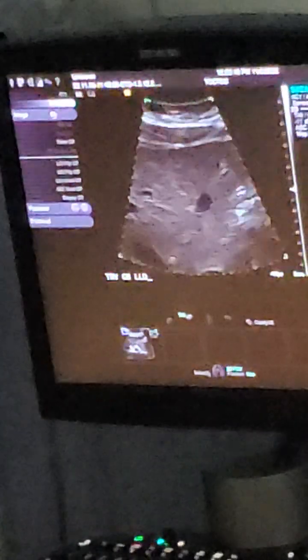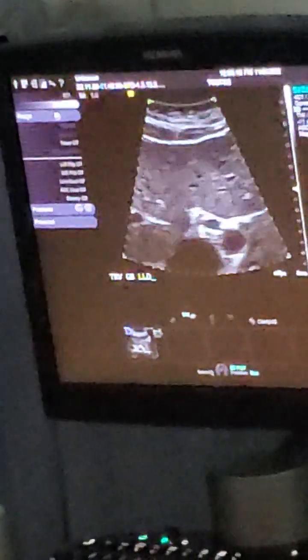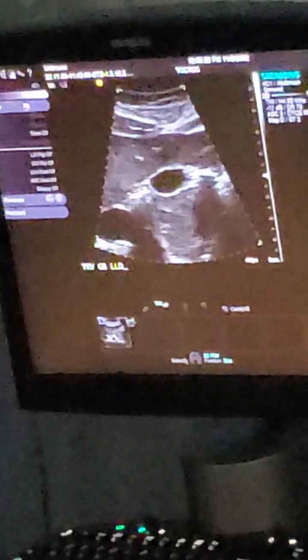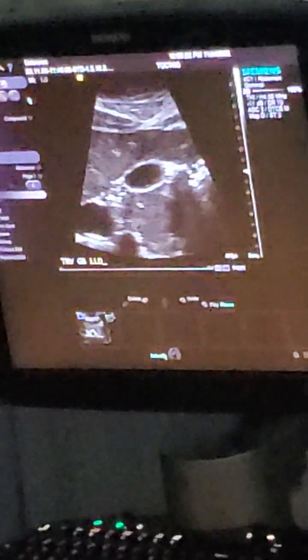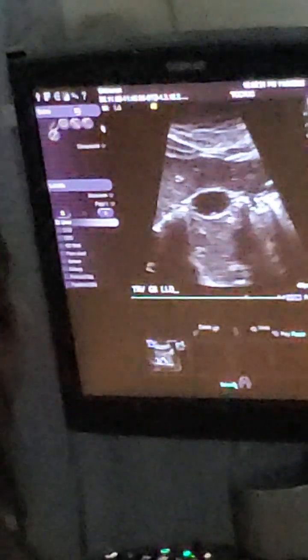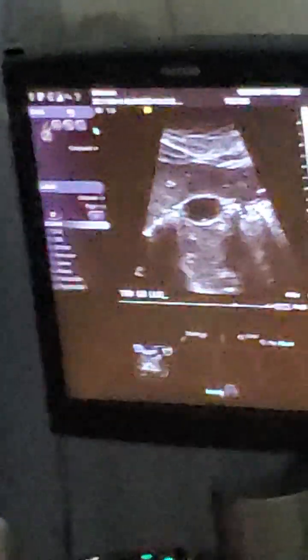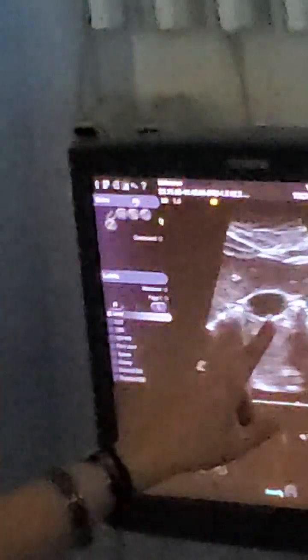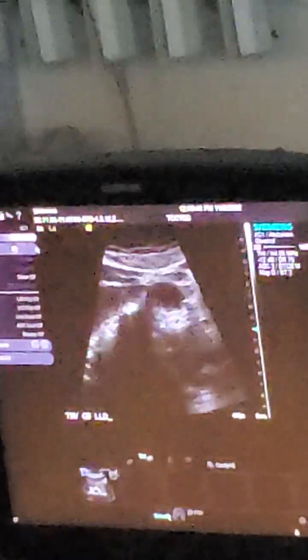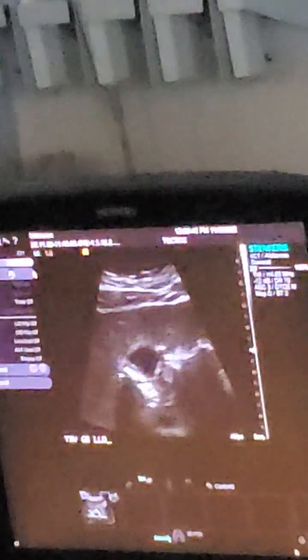So we're up in dome land, coming down to that portal vein, cruising around. Waiting for the gallbladder neck to show up. Then we're in the body. We'll take one in the body. You seen it? And what caught your eye about it when I scanned through? It's kind of a blip, wasn't it? Couldn't be.